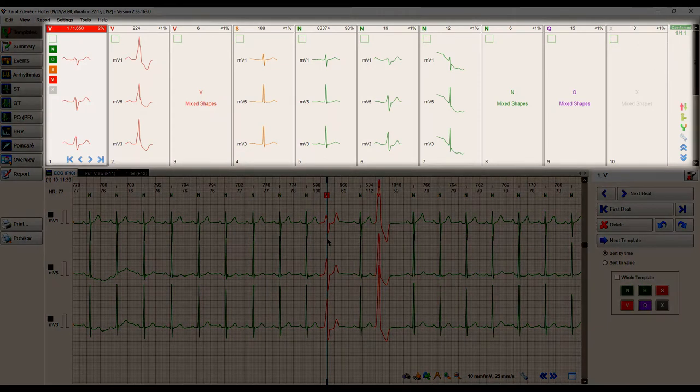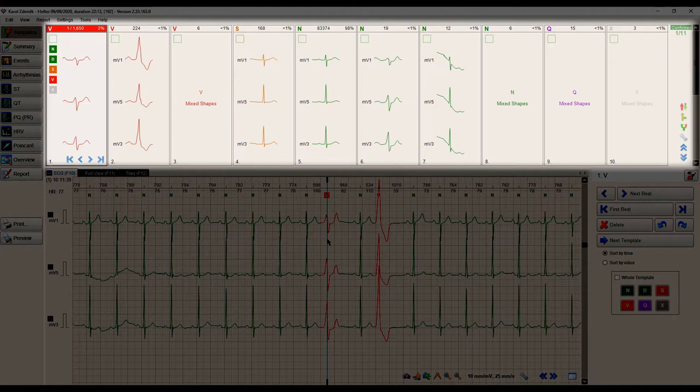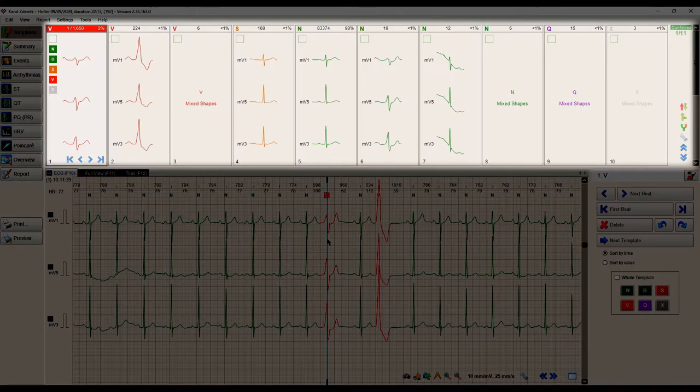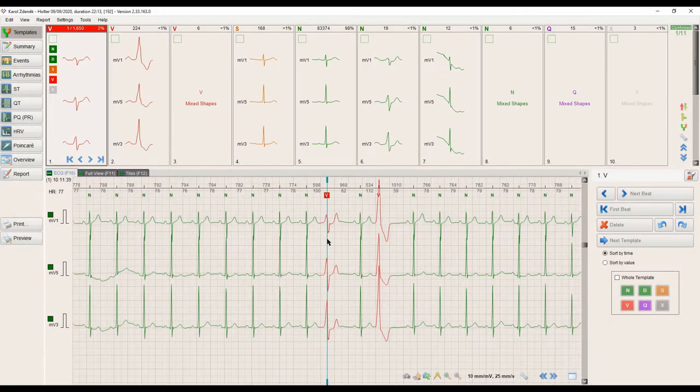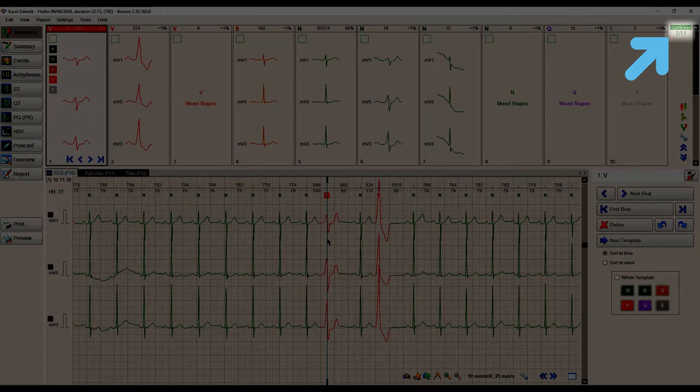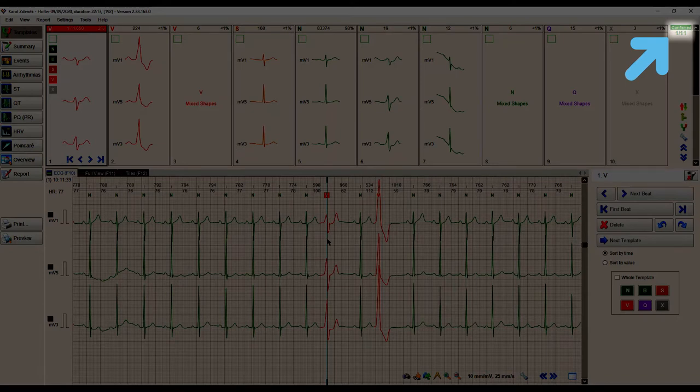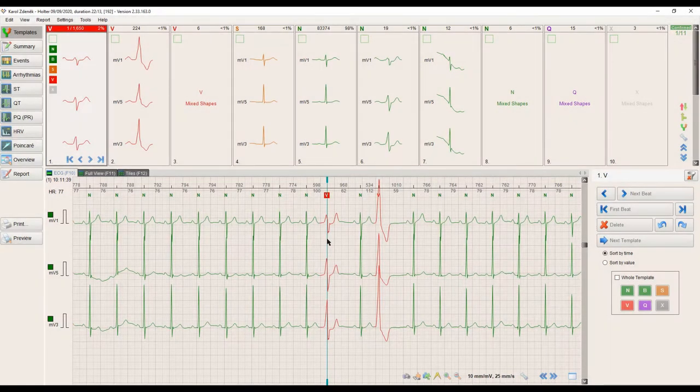All beats from the Holter ECG record are automatically divided into distinct groups based on their shape and ECG classification. In this case, we have 11 templates arranged in order from pathological to normal.